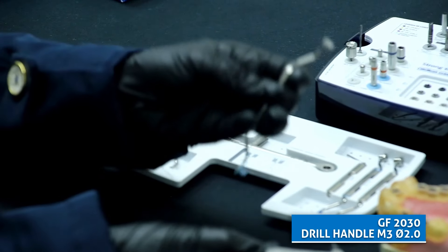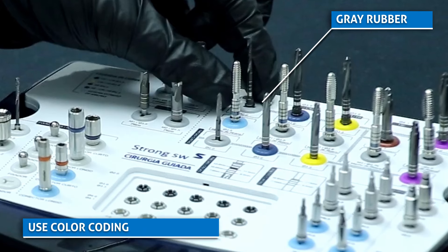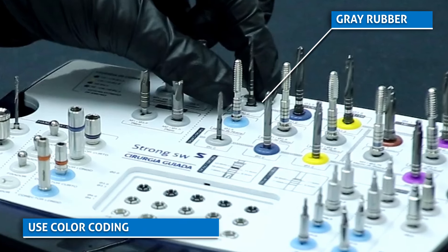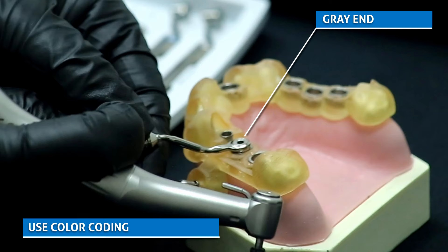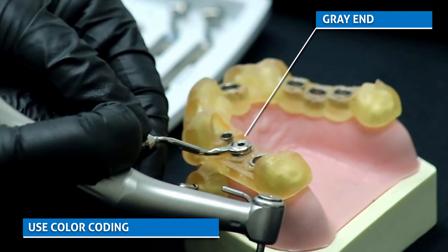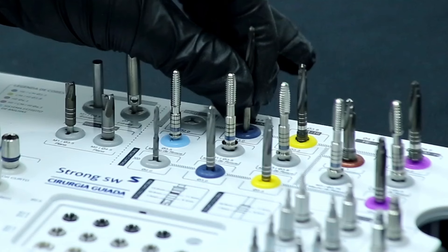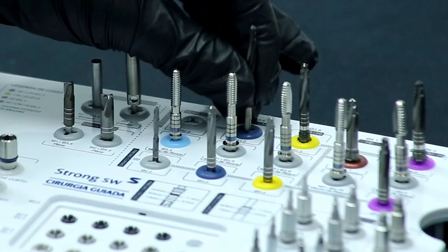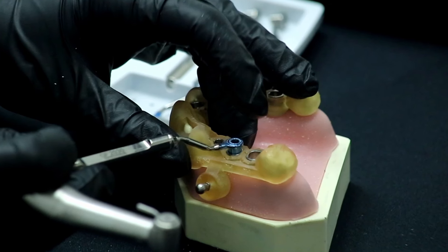Fit the stopper and select the 2.0 drill handle. Also note the color coding — the twist drill has been removed from a grey rubber on the tray, so the end of the drill handle will also be grey. This color coding follows the entire drilling sequence. For example, the next drill that is attached to a blue rubber must be used at the end of the blue drill handle, and so on.